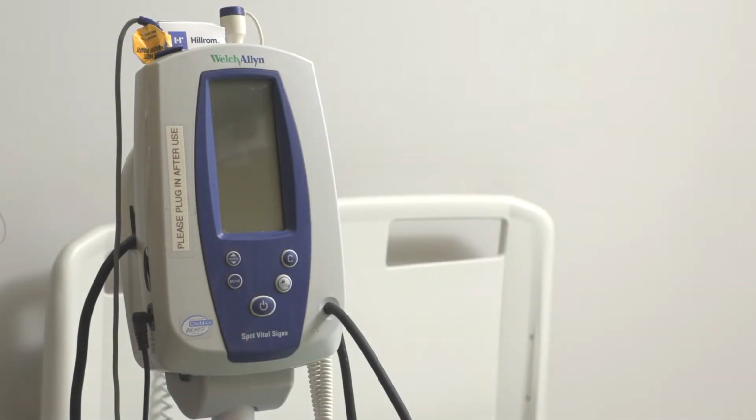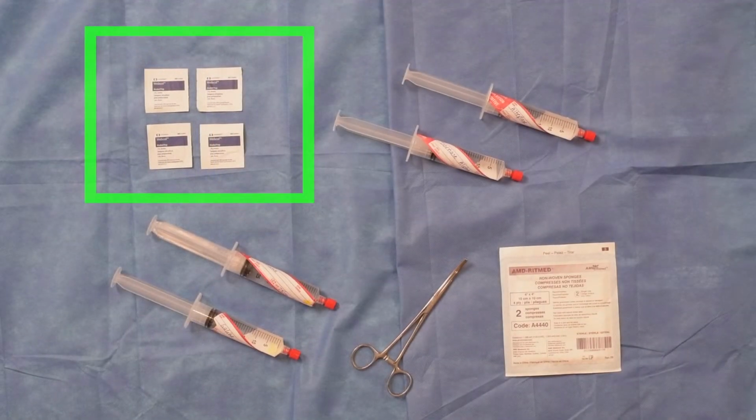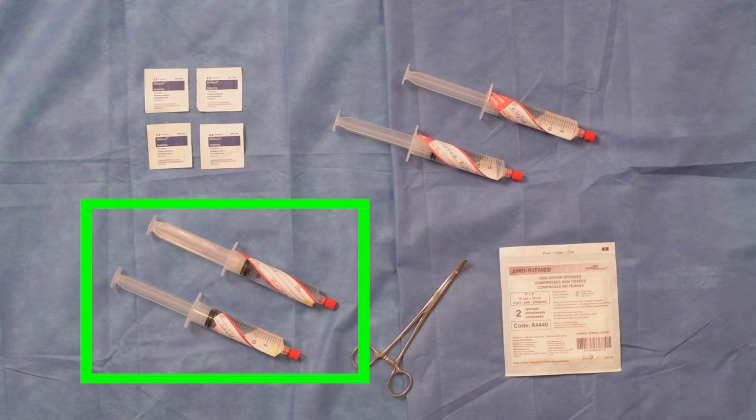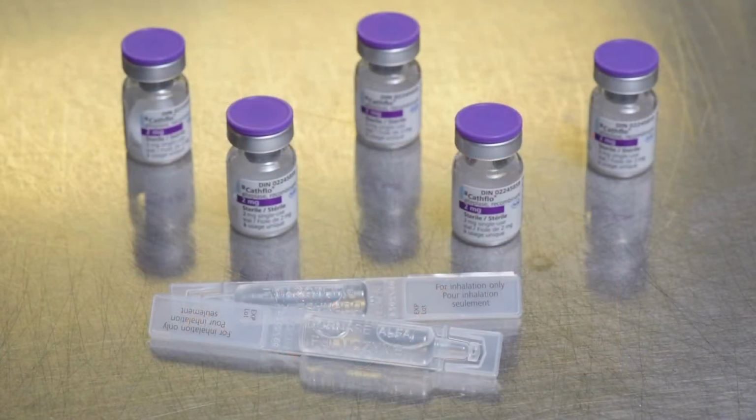This is the equipment that will be required. Equipment required to take vital signs, 4 alcohol swabs, prepared syringe of alteplase, prepared syringe of dornase, 2 prepared syringes of 30 ml of sterile normal saline, hemostatic clamp, and 4x4 gauze. Refer to the procedure for reconstitution of medications as needed.